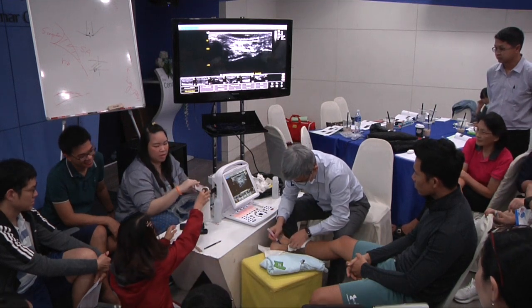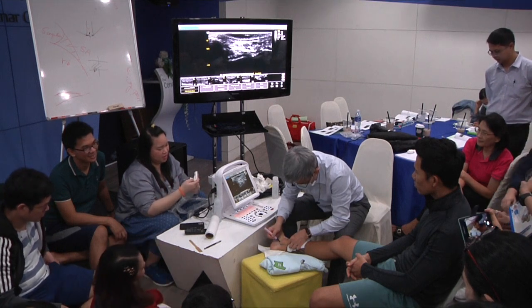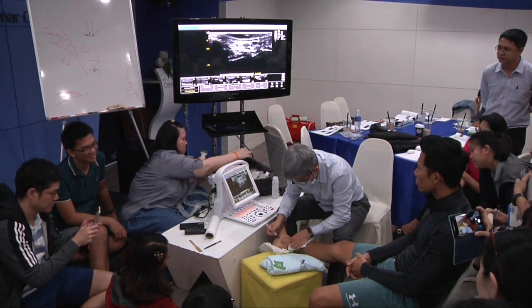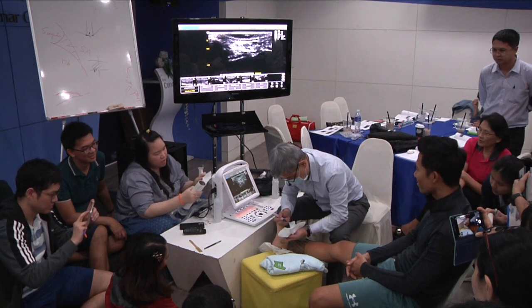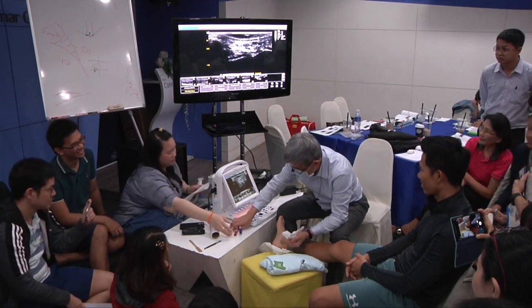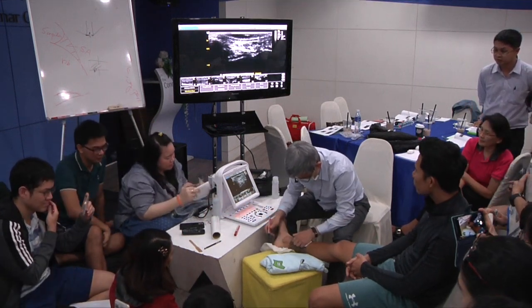For the medial malleolus, straighten his knee. Good. Yes. Thank you. Okay, cool. Right.